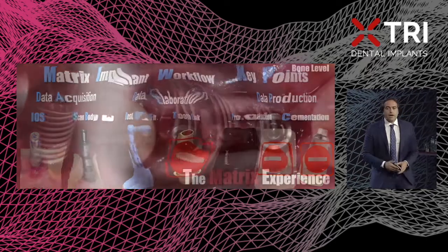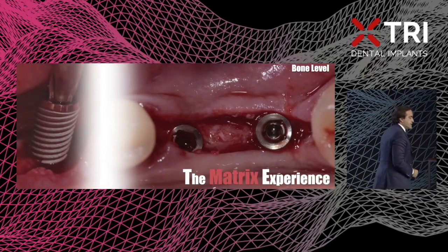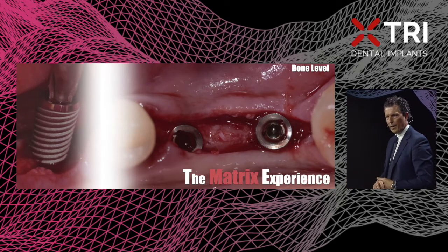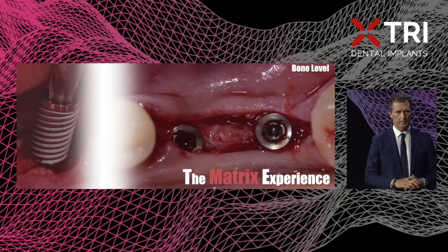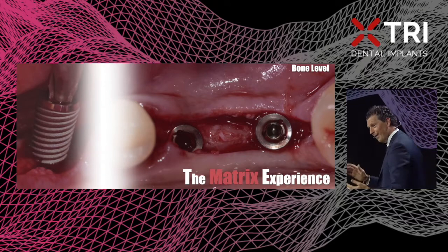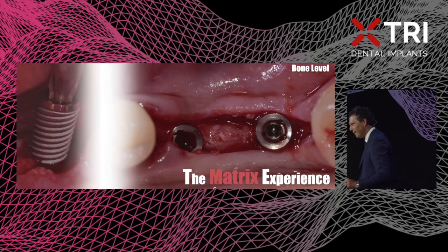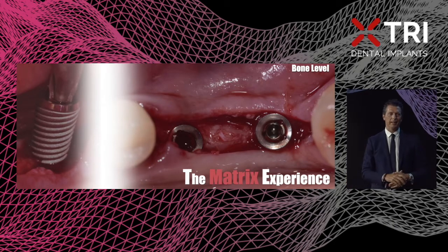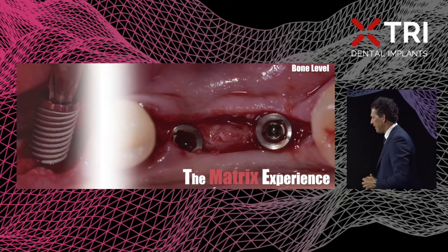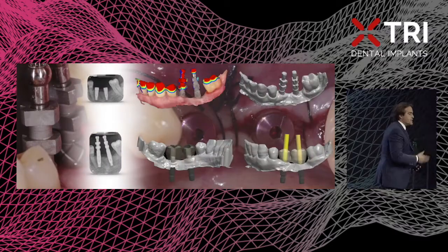So let's review now what has been our experience with the matrix. This is the very first case. We started with 2 implants in the back region, 2 bone level matrix implants, because my experience is on bone level, but I saw immediately the tissue level matrix implant, and after this first case, I used this kind of implant. And here you see the digital workflow.